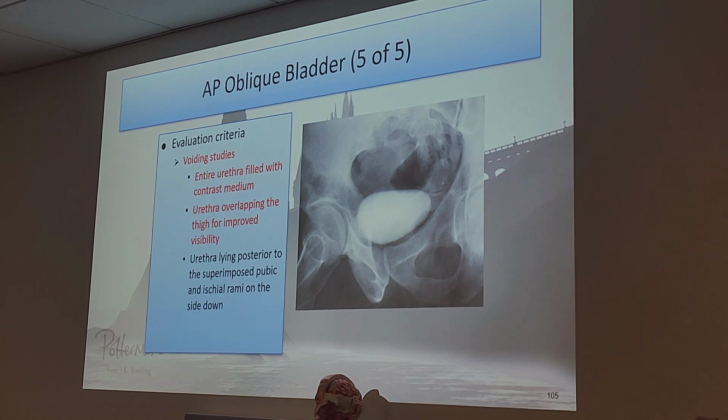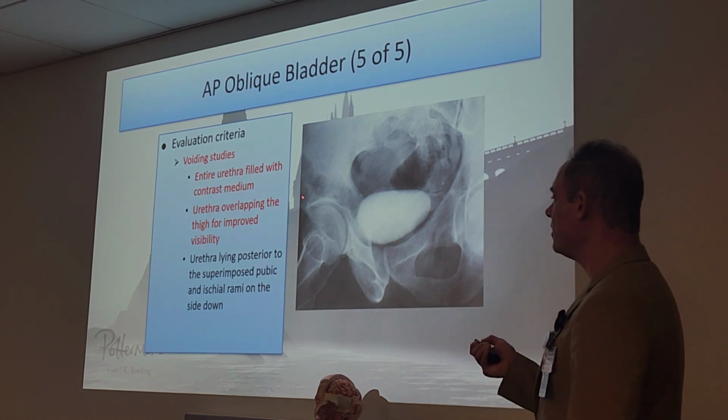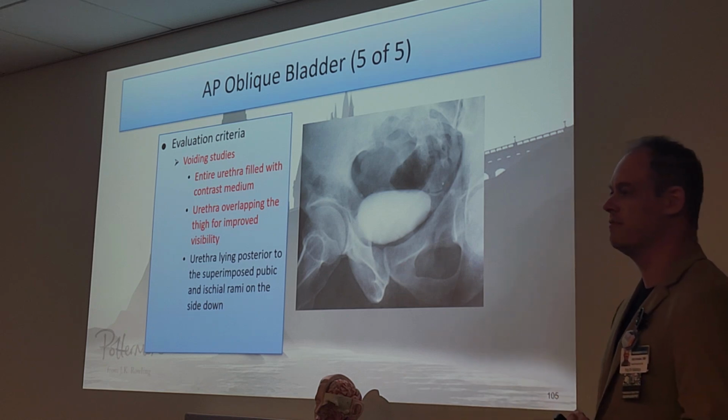So we're only looking at the urethra first? For voiding, bladder and urethra specifically.